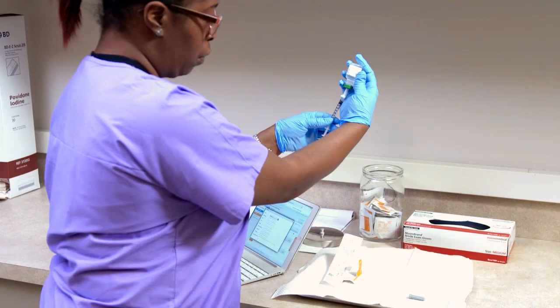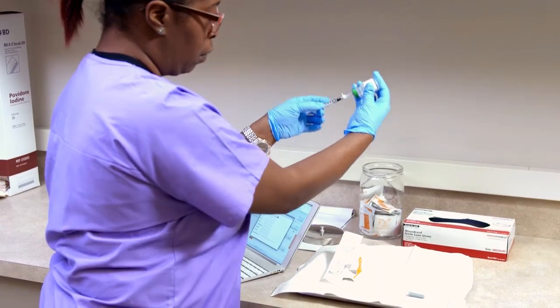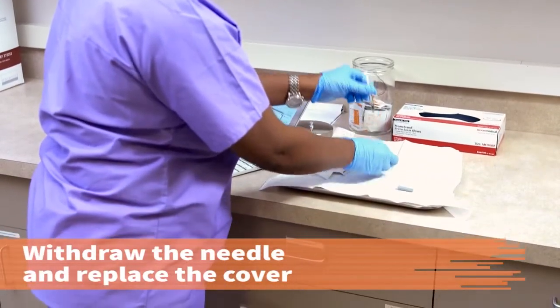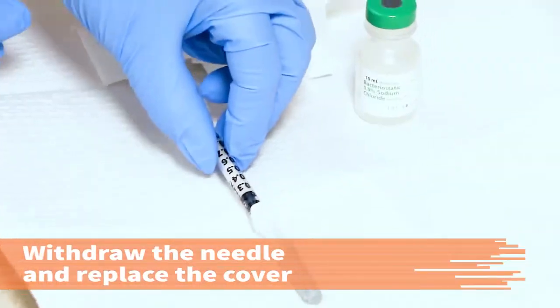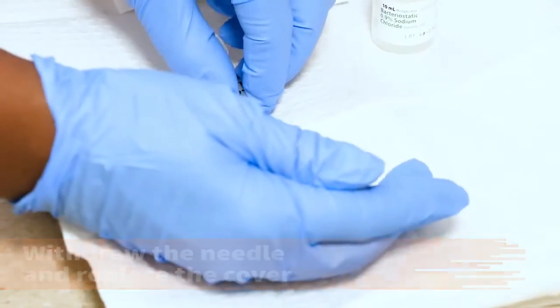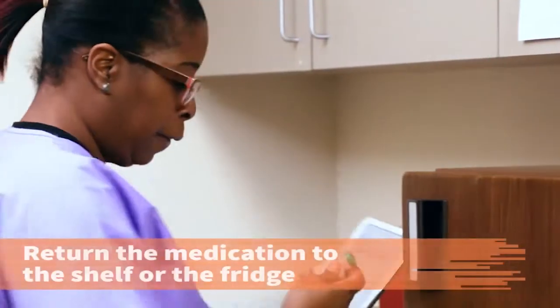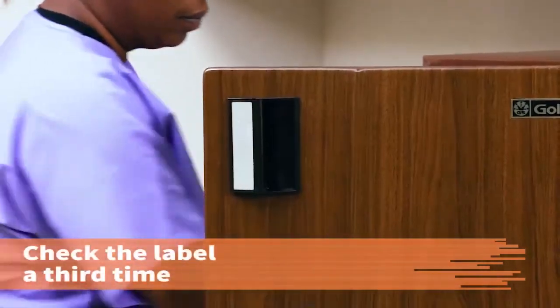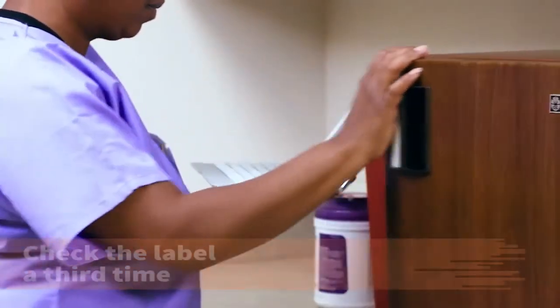At eye level, make sure the accurate amount of medication is in the syringe unit. Withdraw the needle from the vial and carefully replace the needle cover without letting the needle touch the outside of the cover. Return the medication to the shelf or the refrigerator, checking the order against the label one more time to complete all 3 label checks.